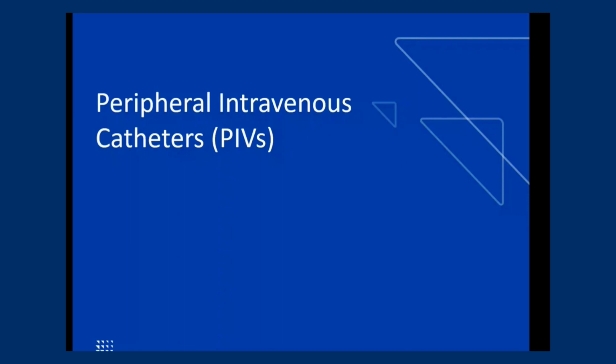I work in the MICU. I'm going to be talking a little bit about peripheral catheters and then also arrows. So our peripheral catheters, unlike a central venous catheter that we spoke about, just start and end in an extremity. These cannot be placed when there's a do not use band. We all know those pink bands. And we must flush these every 12 hours, so at change of shift, and we do that with our sodium chloride syringe.